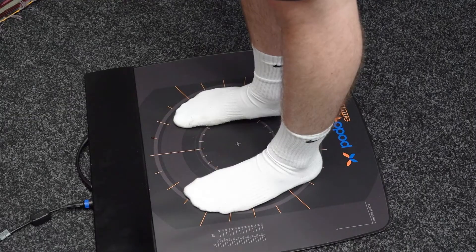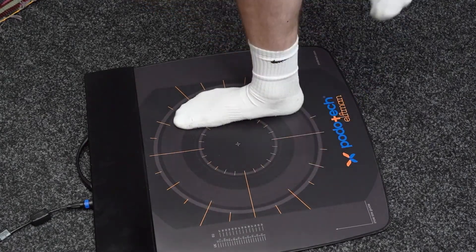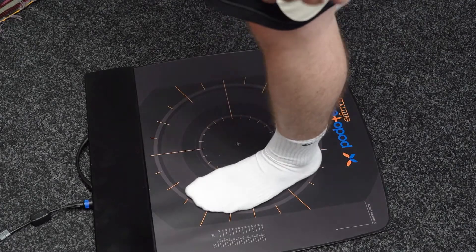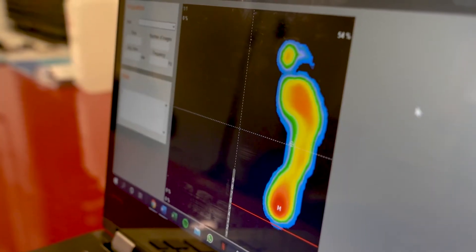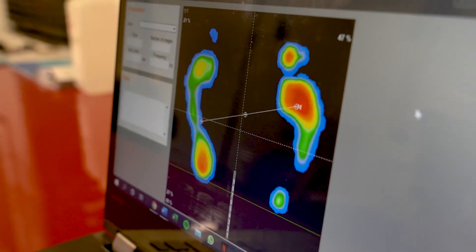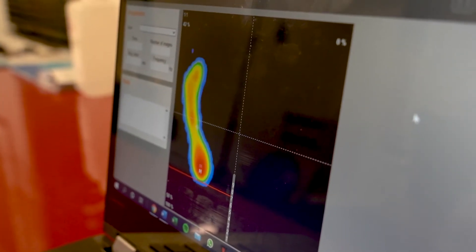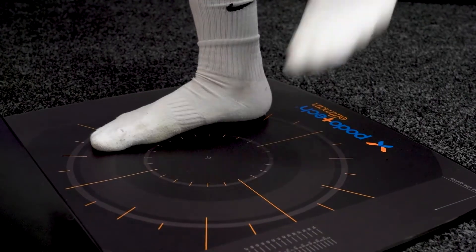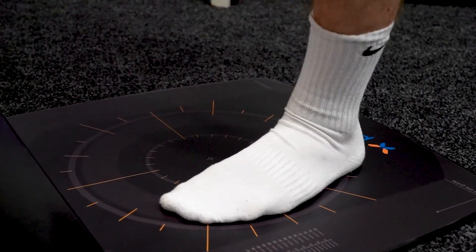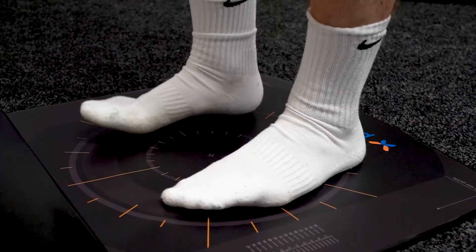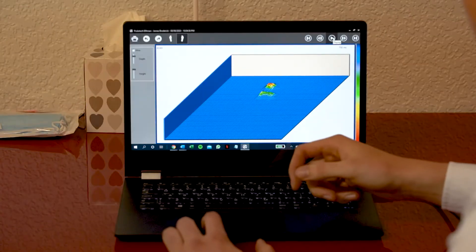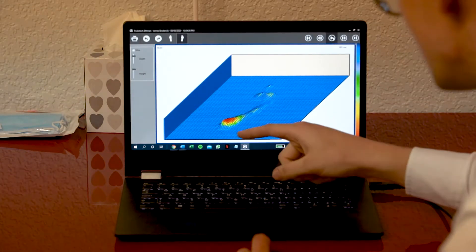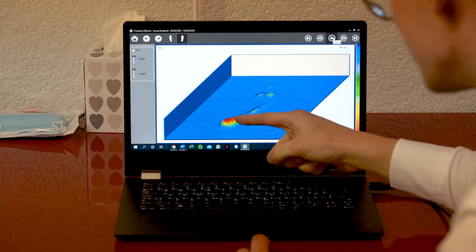Dynamic. Here we can see how the foot moves during gait. We can identify any abnormalities that cannot be seen during traditional gait analysis, and address any issues that may be hindering your physical performance. The information in this section includes graphs with gait timings, pressure measurements, and centre of mass measurements.